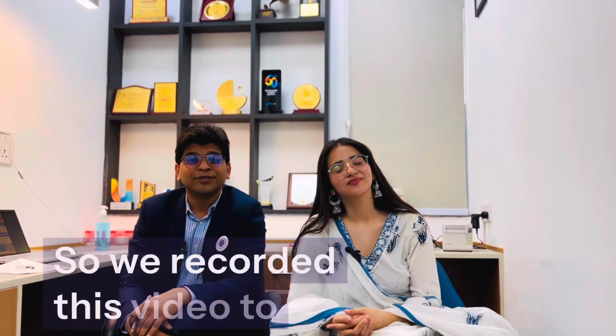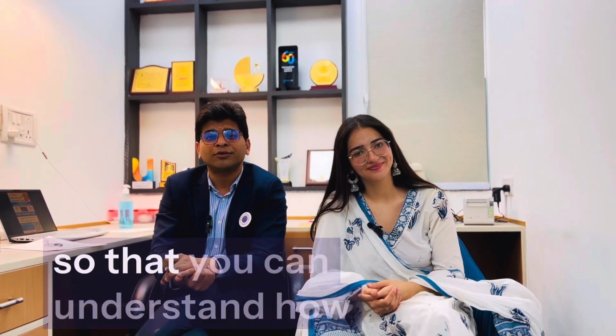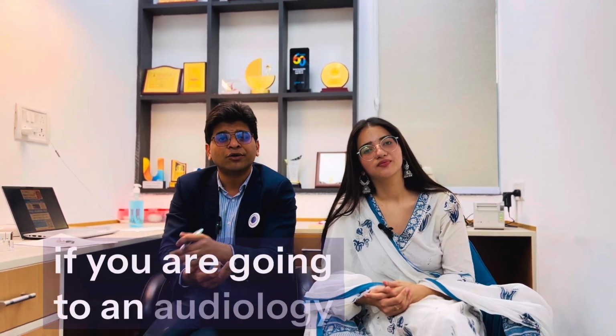So we recorded this video to create an awareness in the general public, so that you can understand how an audiologist works, and what all are the procedures if you are going to an audiology clinic.